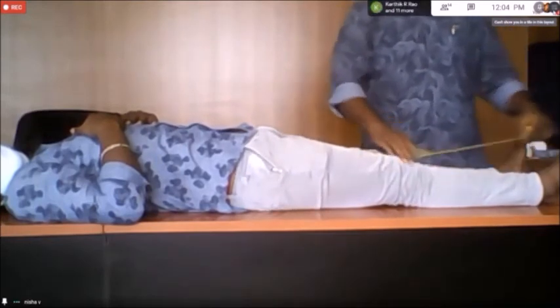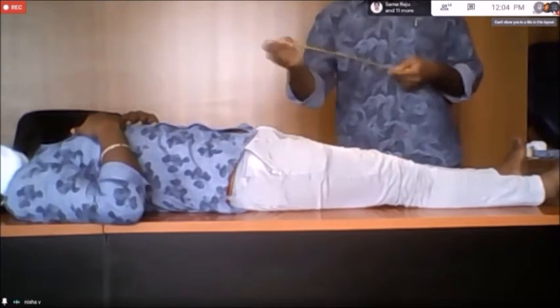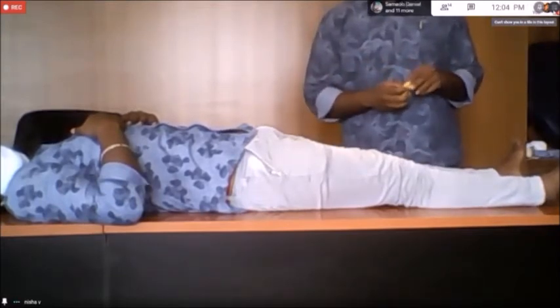The tibial tuberosity is just below the patella. Yes, the same. Okay. So as Samson had said, if it is more than 2 inches, then it becomes difficult for the person to use the wheelchair, because we also have a knee support. So if the femur length is lesser, then one knee would be forward compared to the other knee. That will have an impact on the stability of the person in standing.